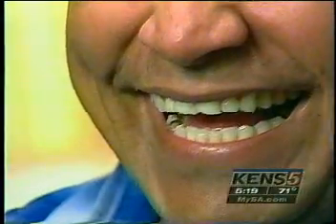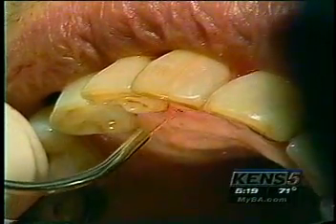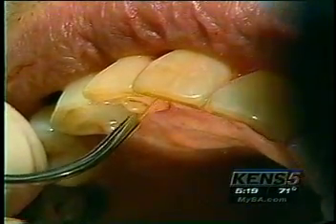The result is a long-lasting, disease-free smile for patients like Tom Solis, who had deep pockets around his teeth — inflammation, bleeding when you brush your teeth, and soreness. After one laser session and a short recovery time, Tom's mouth is much healthier.